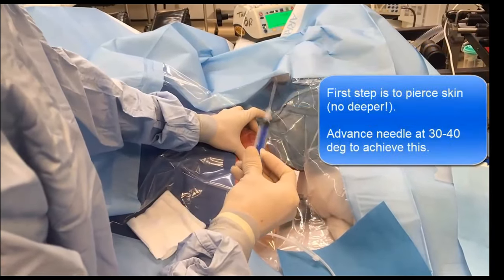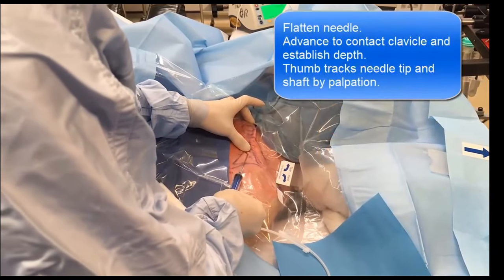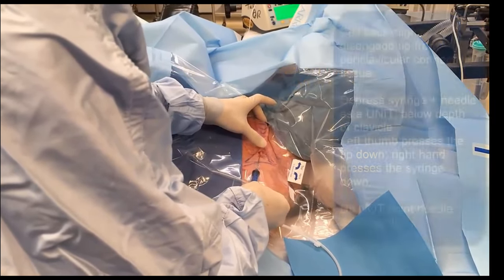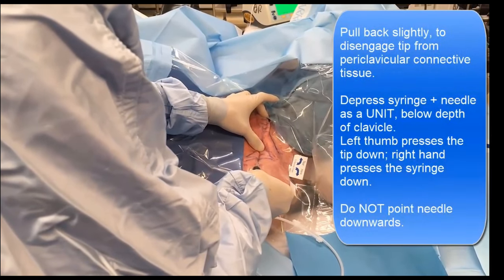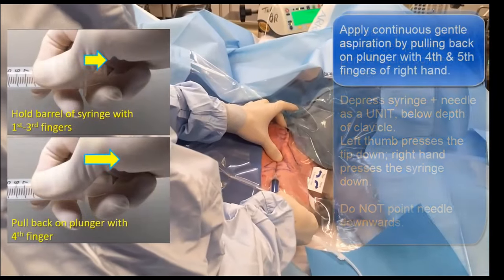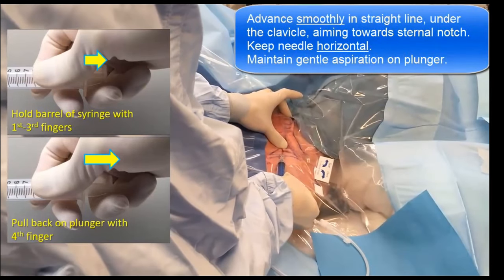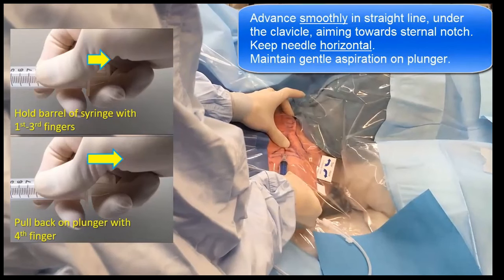Insert the introducer needle through the skin and into subcutaneous tissue. Track the needle tip with your thumb as it is inserted and advance to gently contact the clavicle, establishing its depth under the skin. Withdraw the needle slightly to disengage it from the periclavicular connective tissues, then push down with your thumb on the needle and with your other hand on the syringe so the entire assembly remains horizontal and makes a parallel shift downwards. Hold the syringe so you can apply gentle aspiration on the plunger while retaining firm control of the barrel. Advance the needle towards the sternal notch, letting it slide under your thumb but not allowing it to bend, advancing slowly and smoothly parallel to and under the middle half of the clavicle while keeping constant gentle aspiration.